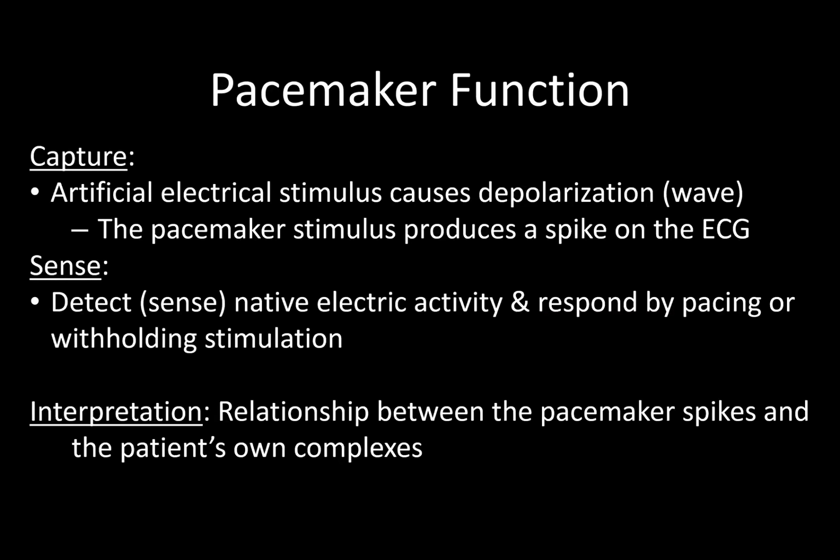Pacemaker function. Some additional terms that I have mentioned but not quite explained yet: capture, sensing and interpretation. Capture is essentially the heart reacting to the pacemaker impulse. Going forward with this section, I'll refer to pacemaker as PM just to keep it short.